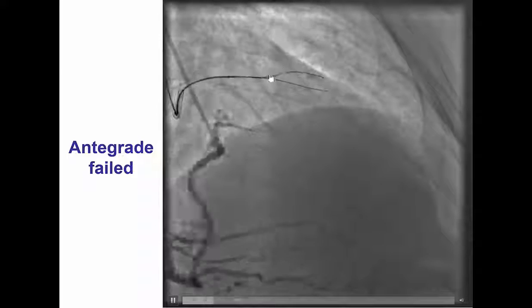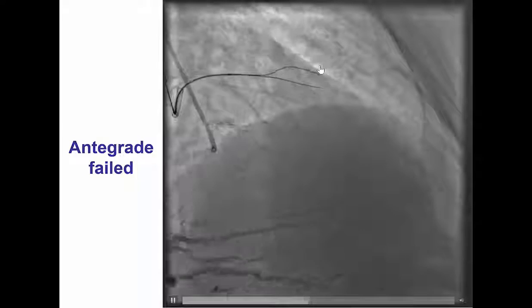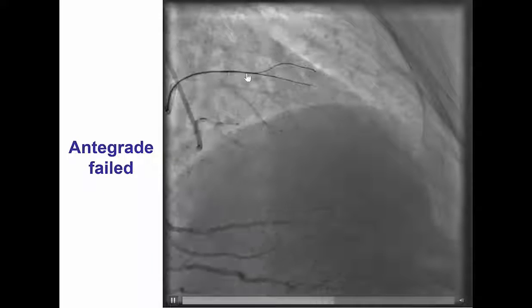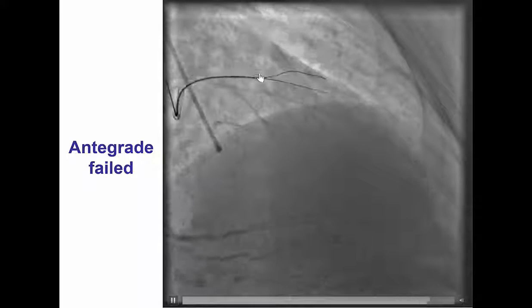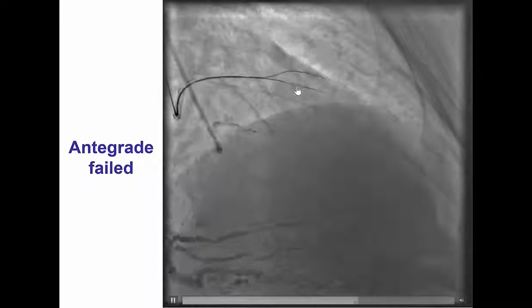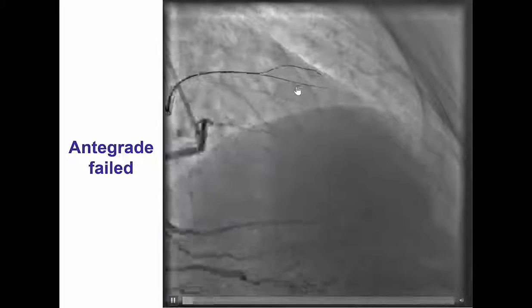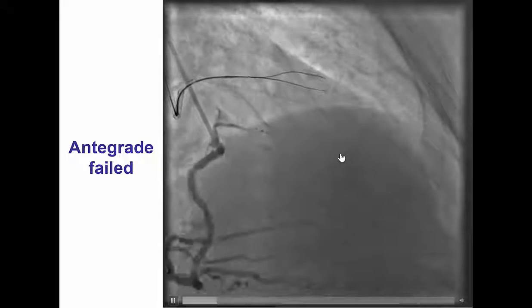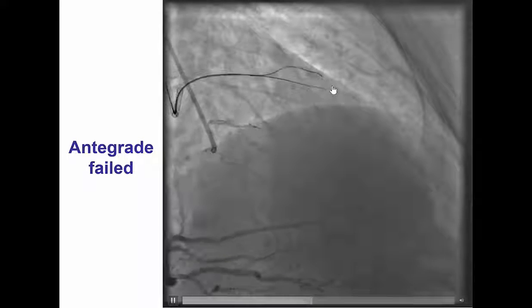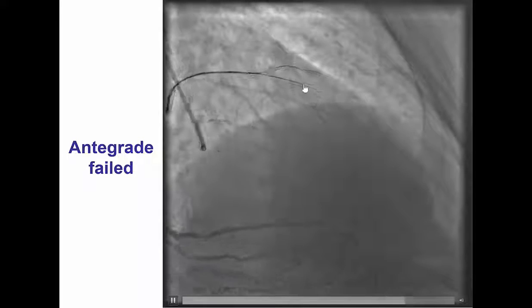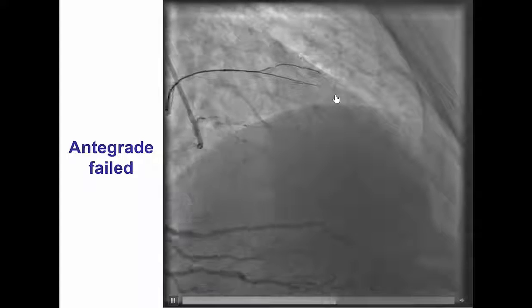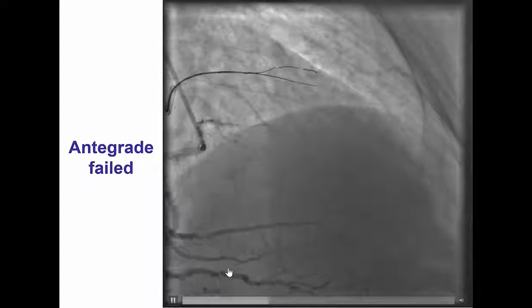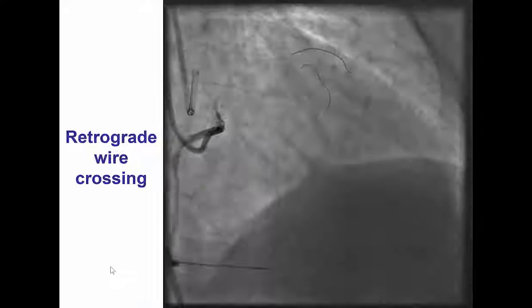We advanced a safety wire into the diagonal branch and then performed antegrade wire escalation with various wires including a Confianza Pro 12. However, the wire did not follow into the LAD — it was going probably subintimal into the diagonal branch. That is why we decided to try retrograde crossing.